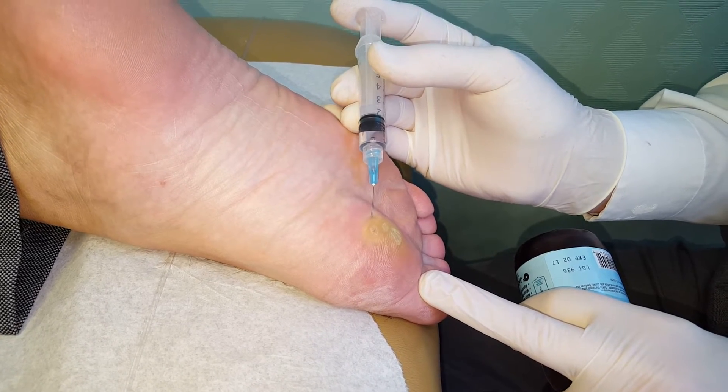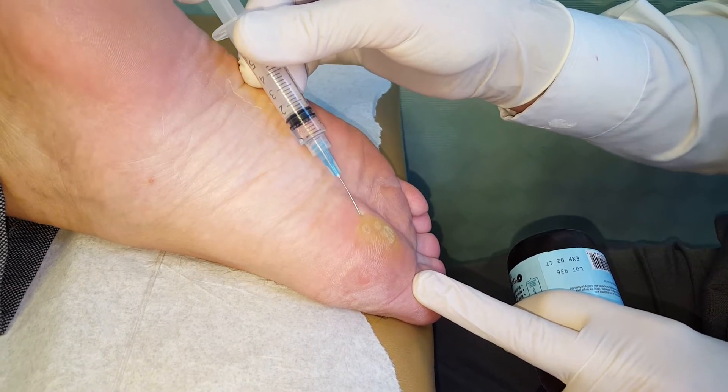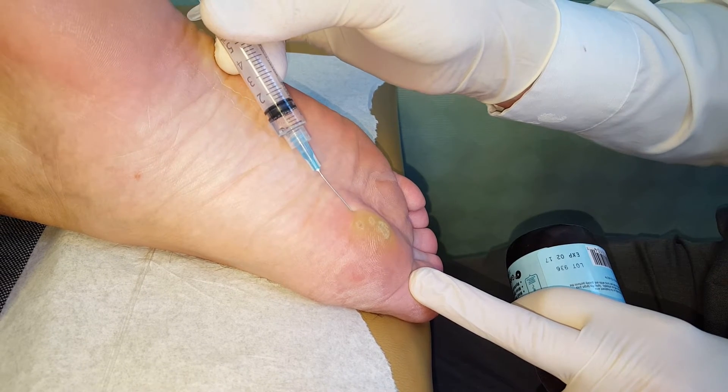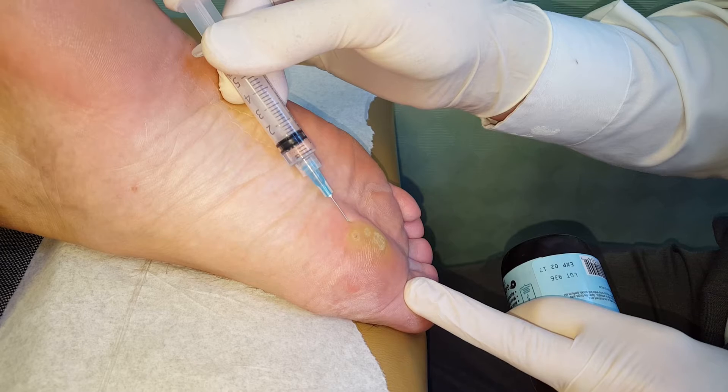It's Monday — wart day. This is wart day today. We'll get this whole area.